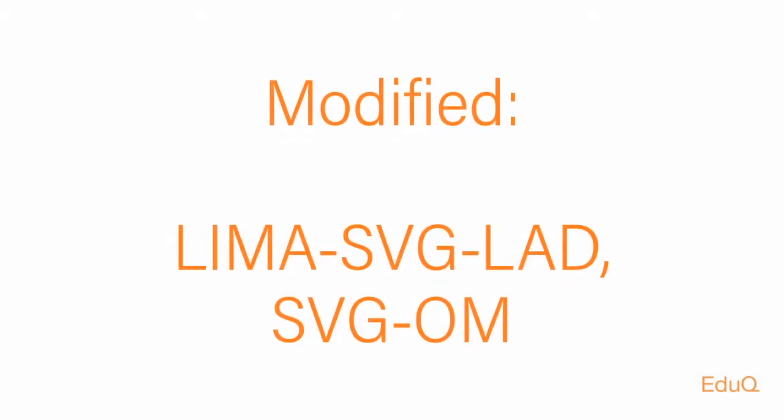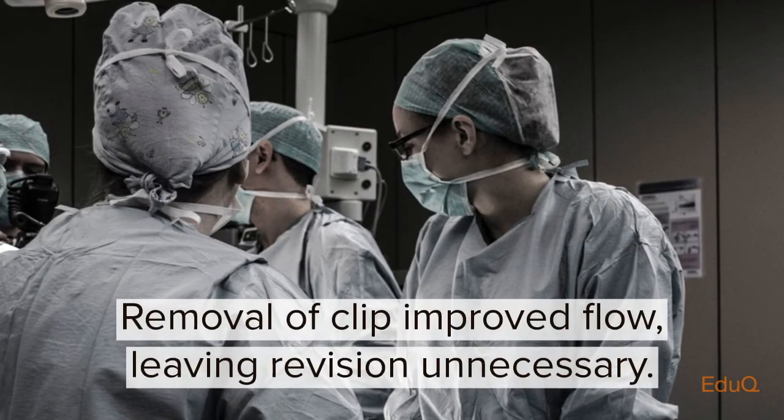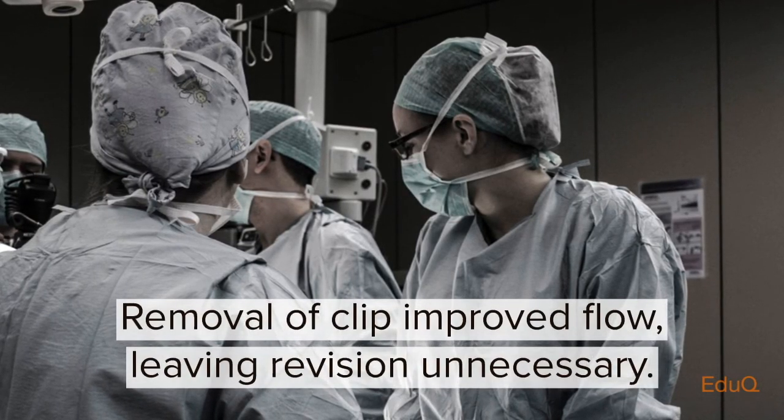The Lima turned out to be a bit too short, so they lengthened it with a piece of SVG. So in this case, removal of the clip improved flow, leaving revision unnecessary.